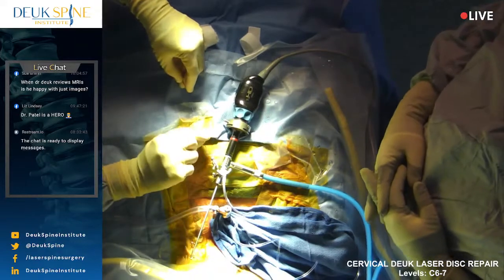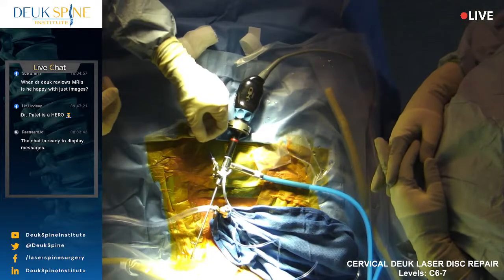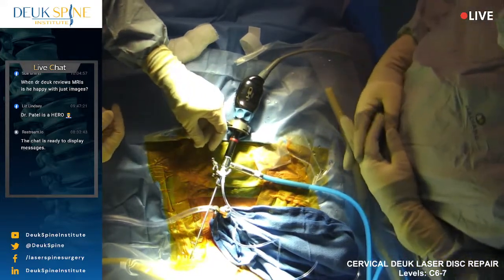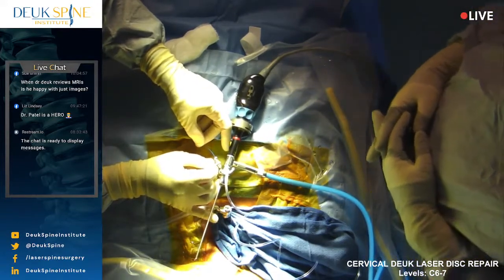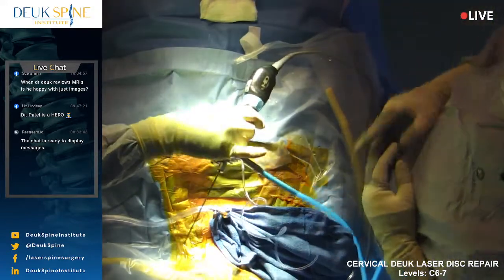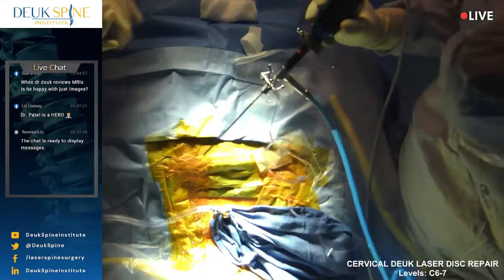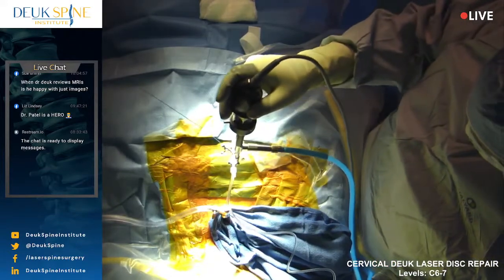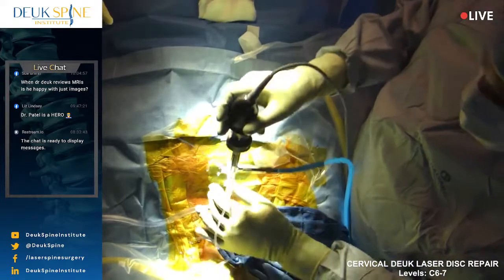All right, so we just had to white balance our camera. What that means is we're telling the camera what the color white is. That way it gets all the colors right during the surgery. Remember, the camera is a digital system. So it's taking an image and then digitalizing it and then rebroadcasting or projecting it. So if the camera system doesn't know what white looks like because you haven't told it, then it could make some really weird colors. So we have to tell the camera what white is. We call that white balancing. Pretty standard for endoscopic spine surgery.